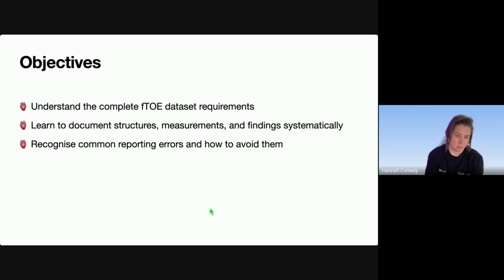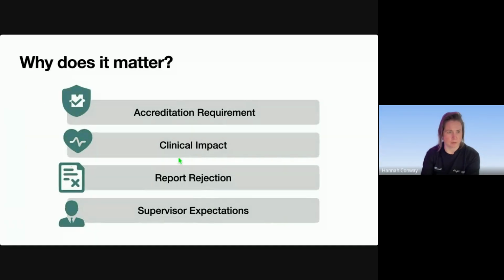And this is a bit of an insight for those of you who are doing focused TOE. Hopefully it will enable you to feel more confident when you're coming toward the exam part, because I'm going to share with you some of the more common reporting errors that we are seeing and how to avoid them, essentially, before you have to have a resubmission.